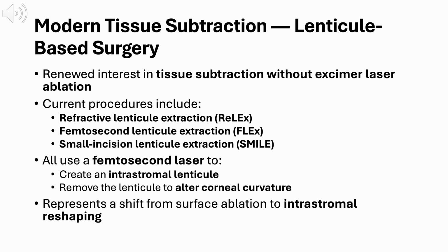This slide brings us back to tissue subtraction, but in a modern form. There has been renewed interest in subtracting tissue without using excimer laser ablation. Instead of removing tissue from the surface, these newer approaches reshape the cornea from within. Current procedures include refractive lenticular extraction, or RELEX, femtosecond lenticular extraction, or FLEX, and small incision lenticular extraction, known as SMILE. While the names differ, they all share the same fundamental mechanism.